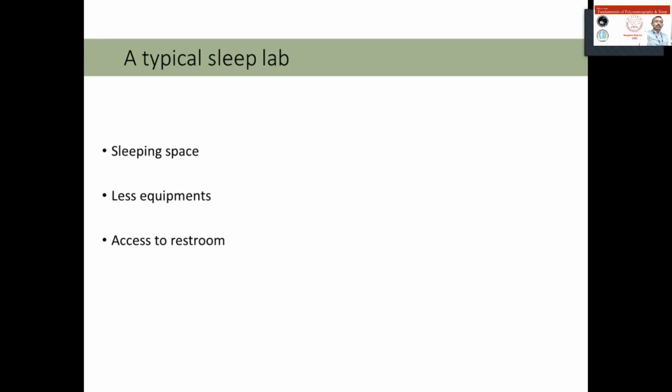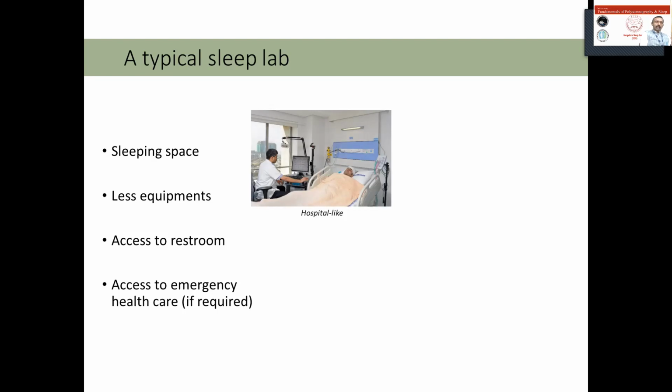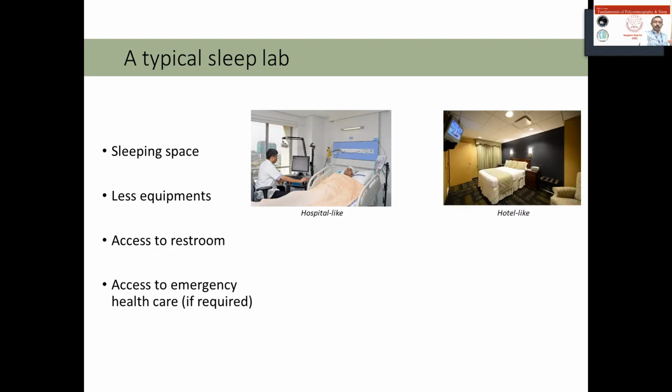uncomfortable. There should be access to a restroom, because many subjects would like to go to the restroom just before, after connecting all these electrodes, and sometimes in the middle of the night too. And sometimes after getting up, it will be easier if the restroom is nearby. And in case you're studying any medical condition, then access to a medical health emergency facility would be required. A hospital-like environment would be one case, but the problem is, if you have spent time in a hospital, your sleep will be completely deranged in such an environment because of the noise and the occupancy.